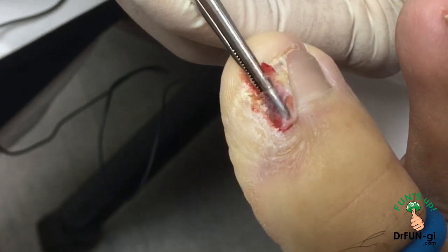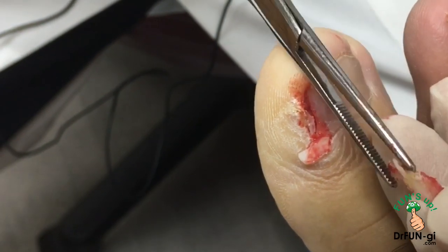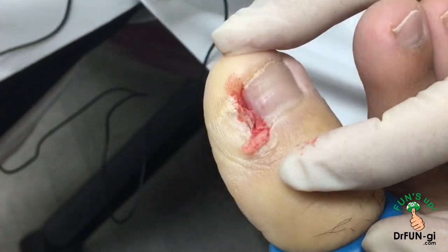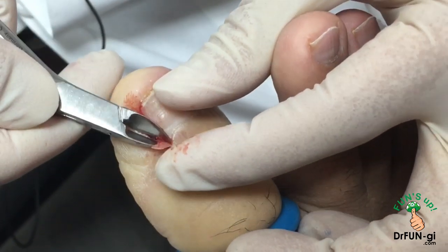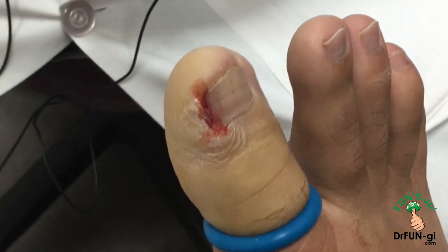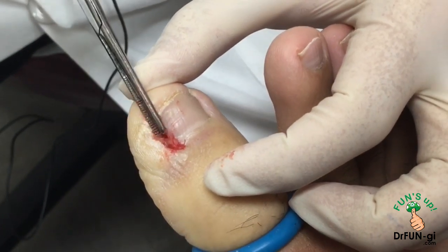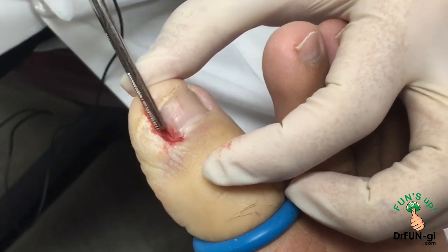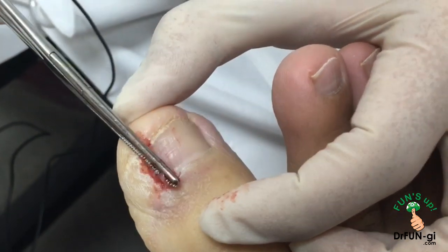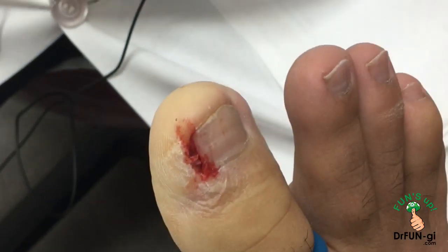I prefer cutting it out. There's a little piece sitting over here which we'll take out as well. Like I said, you can use chemical or you can cut it out like what I do. The chemical way of doing it makes it look really ugly, so I try not to use that method. Some people use it because it's easier, and there's some skin underneath that needs to come out so it drains nicely.